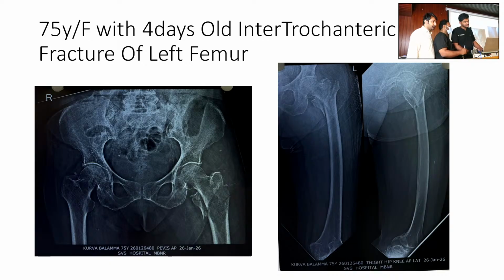If you directly go for freehand technique interlocking, you get a gap, because the muscle forces are deforming forces in the femoral segment. The muscle power is more than the bone power in the femoral segment, whereas in the leg segment the bone power is more than the muscle power. So fatigue fractures are also very high in the femoral segment compared to the tibial segment.